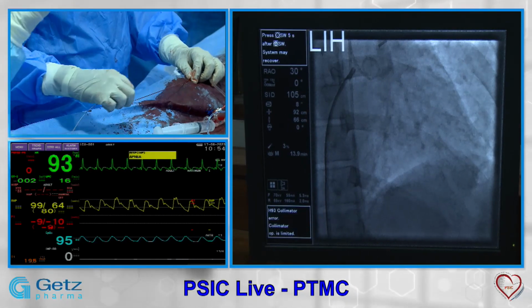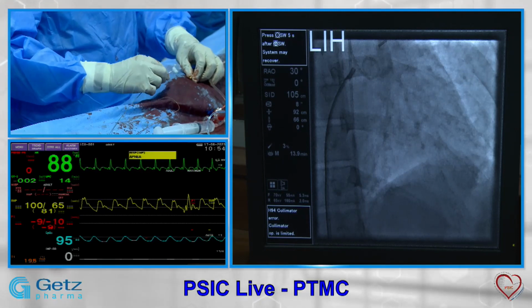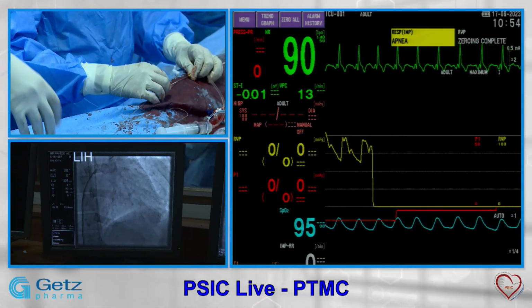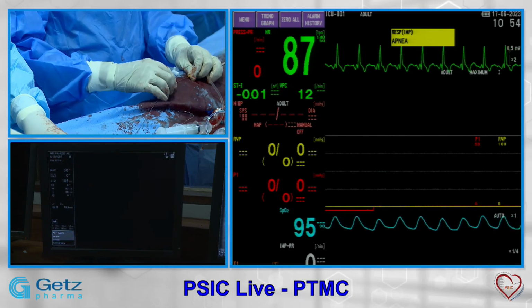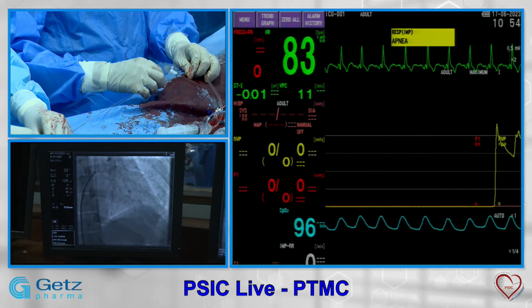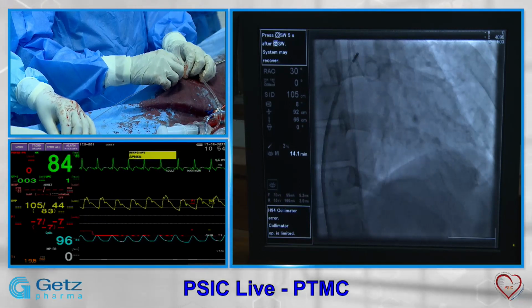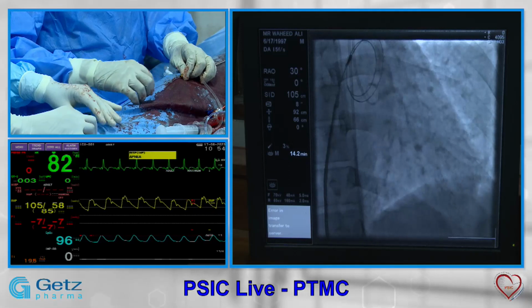Echo, please. Wire, please. Wire, please. So our job is done. No more inflations required.